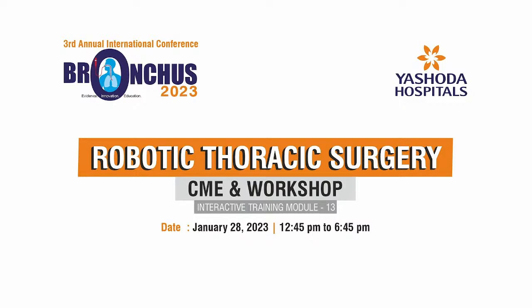In our system it is a little difficult, because if you have to convert, you should be safe enough to do a thoracic surgery on your own rather than going directly to a robotic program. For a senior experienced surgeon, moving into robotics is easier than for a resident. Correct. But if the resident is working in a mature, safe system where there is a lot of backup, probably. And this is Western data. We don't generate our own data. So in our own hands, I think we should say currently that it's probably not safe. But if there is someone to watch your back, then probably it will be.